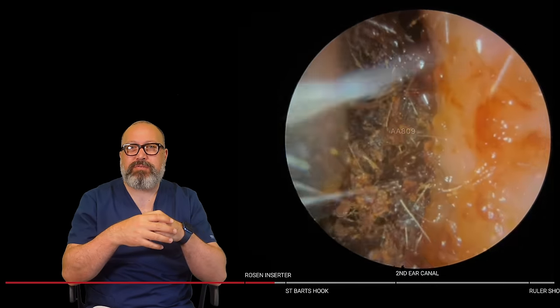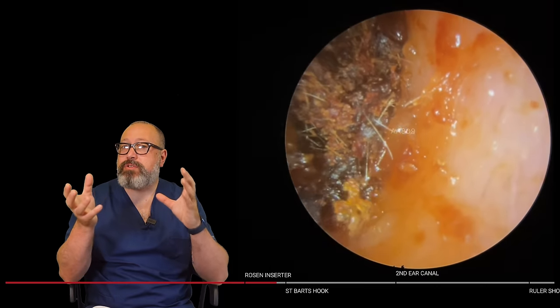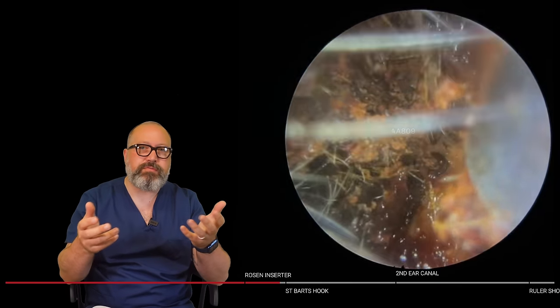So I've switched back now to the Zollner tube just to tidy up some of the little bits. And this happens a lot when you use curettage. When you use a curette, which is any sort of manual tool we've got in the ears, it's known as curettage, but the tool itself is known as a curette.